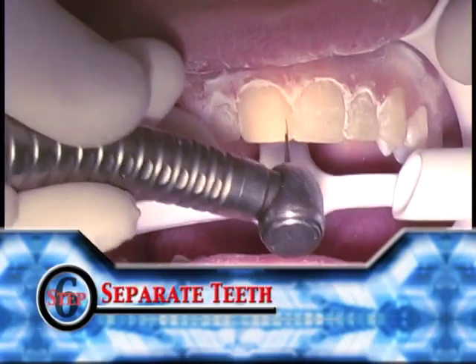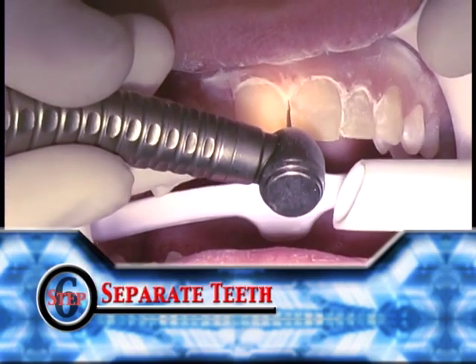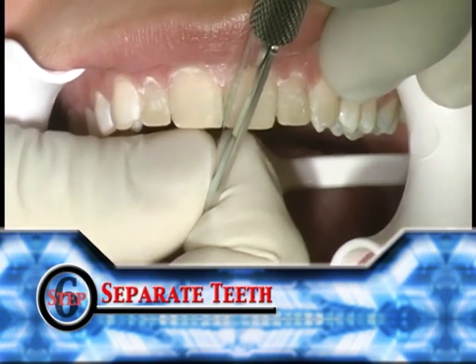The next step is to separate the teeth. Due to the importance of not lacerating the gums, it'll be helpful to score the teeth first to act as a guideline.